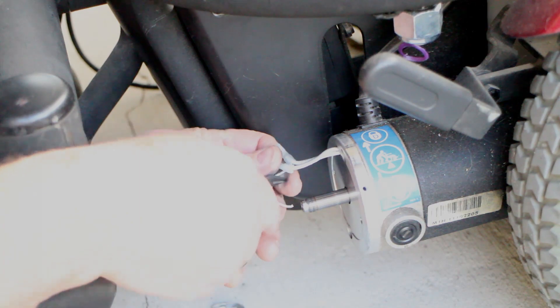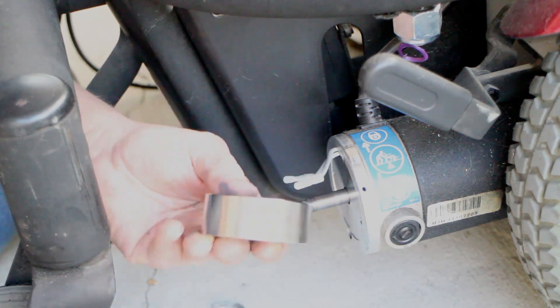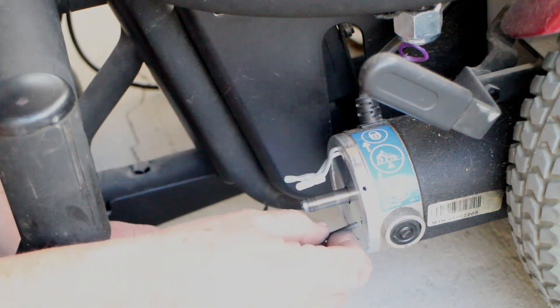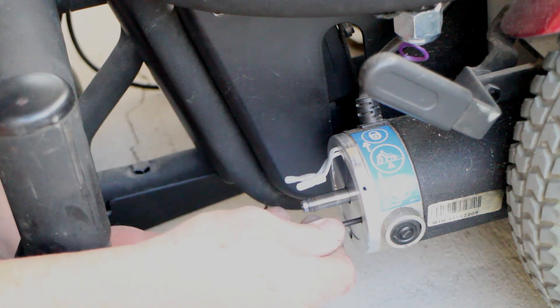I cut the wires close to the connectors in case I ever wanted to reinstall the brakes and make this a wheelchair again. I put one of the screws back in so that I could wire tie those wires to make sure they stayed out of the way of the shaft.